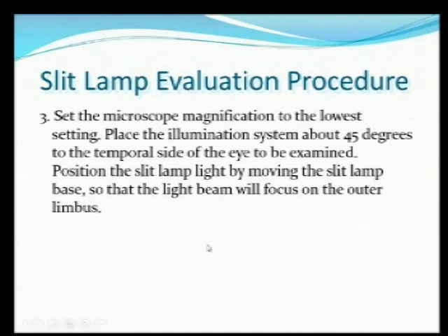You also want to start with the microscope straight on the eye and the illumination system at about a 45-degree angle.